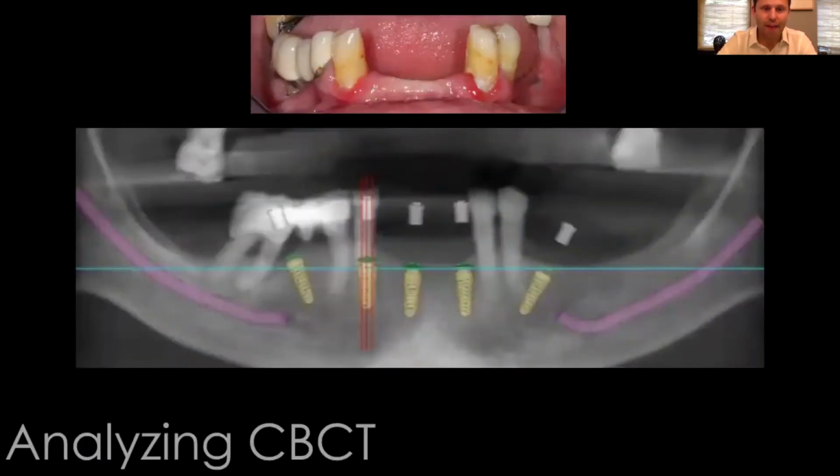I'm going to be placing 5 implants in the mandibular region. The 2 distal ones are going to be angled so that we can get more of an anterior-posterior spread.